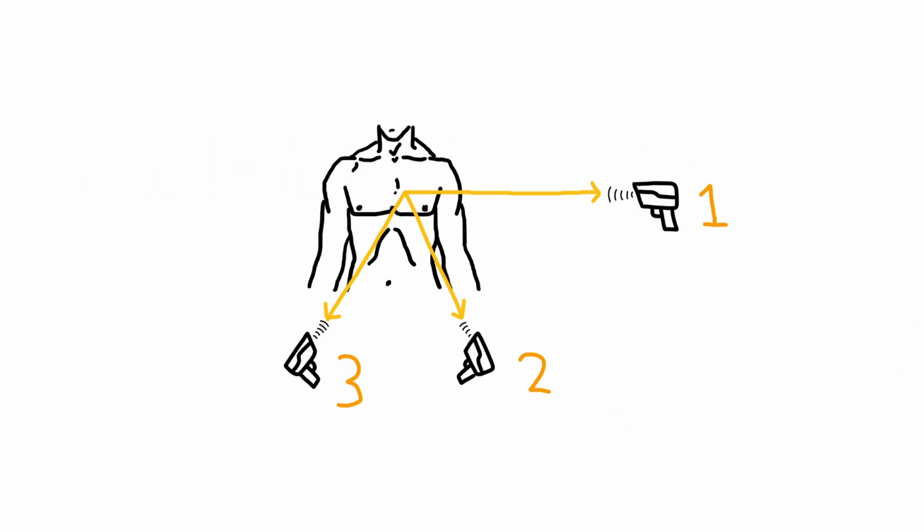Now there are three limb leads you need to be aware of. Lead 1, 2 and 3. Now each one of these has numbers attached to it, but I think the easiest way to remember them for now is that lead 1 points towards your left, lead 2 points towards your left hip, and lead 3 points towards your right hip.